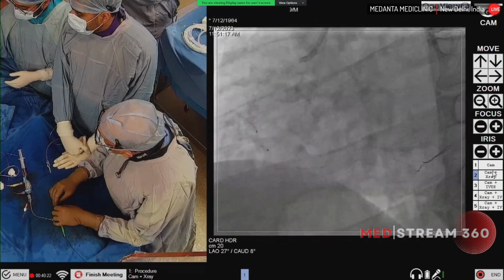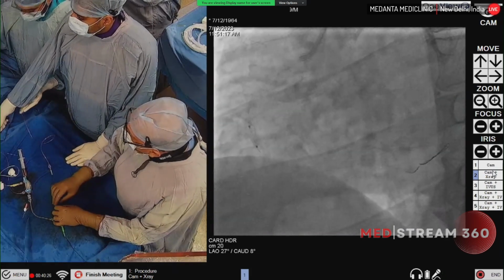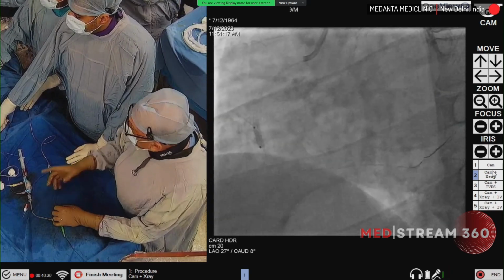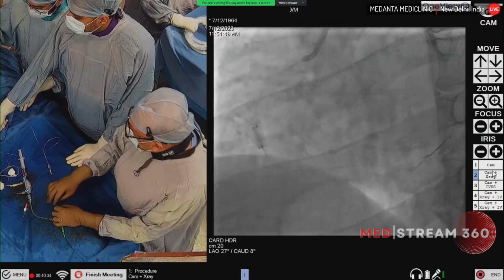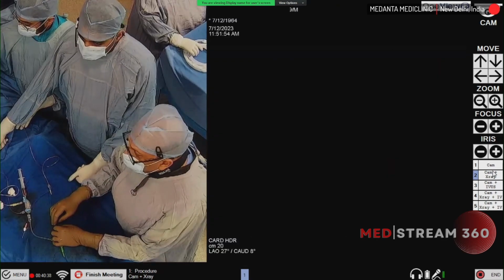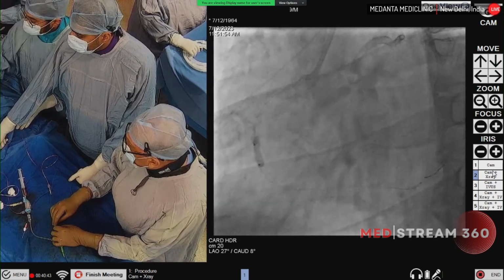Okay, so I can see on the live this thing. Okay, go up, please. 1, 2, 3, 4. So there is the live stent boost. Again, this is a system which comes with this Volcano system. 4. Go up to how much? 4, 5, 6, 7, 8, 9, 10.